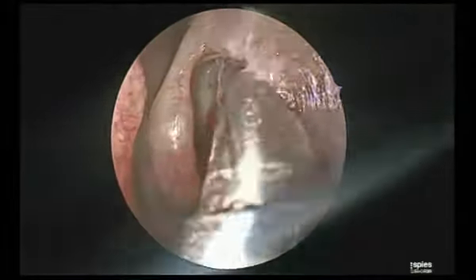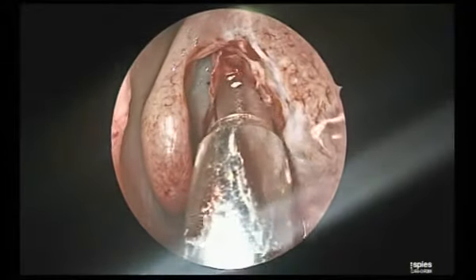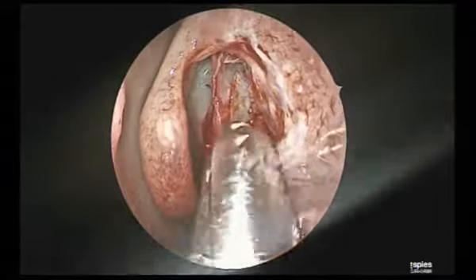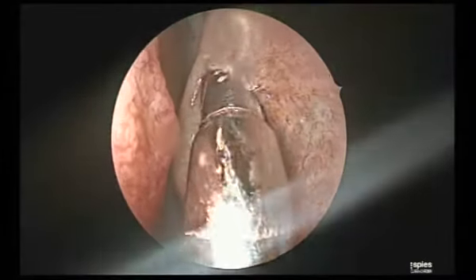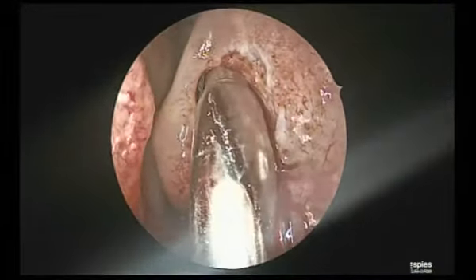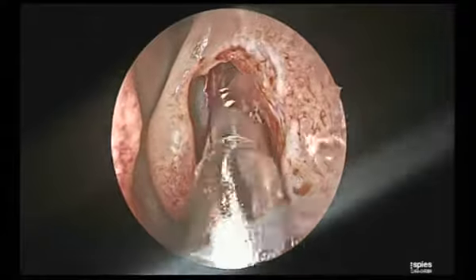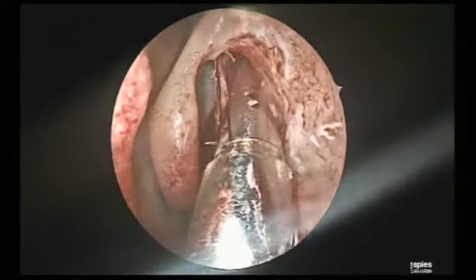Now, what I was trying to say, this upper portion of the uncinate, can you see? It nicely forms the medial wall of the agger nasi. This is the agger nasi, open now. So that's very important. I will go right up to the axilla, right up to where the debrider can debride. Where it stops debriding, you stop. This hard bone cannot be debrided. So that is the point where you have to stop.